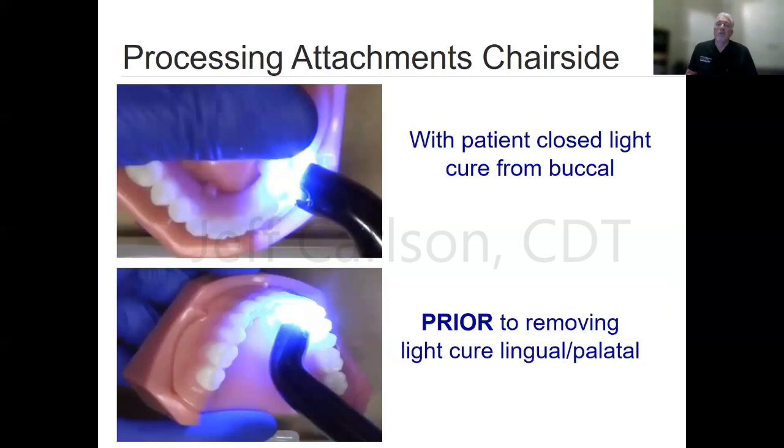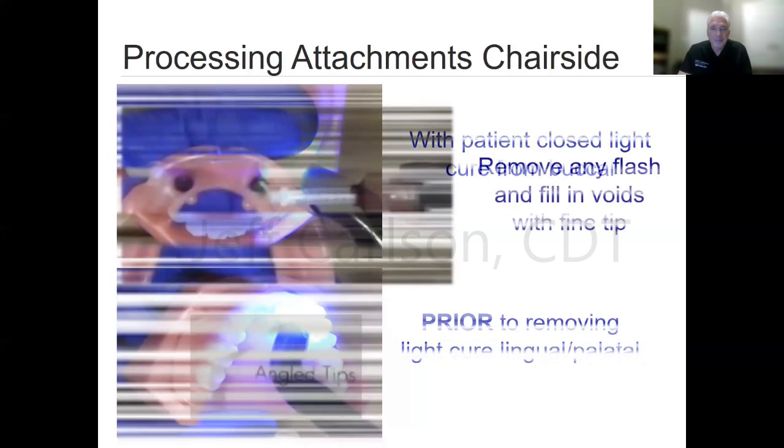Look, don't rush this. One of the worst things that happens is you go in there and maybe you go, oh, I did 20 seconds with the light here and 20 seconds here. And you do the other ones and you take it out of the mouth, and it's just a little string of that material because it didn't cure all the way. Now you've got to start over again, clean that out. So, don't rush this part. Give it time. Let this dual cure portion do its process as well.